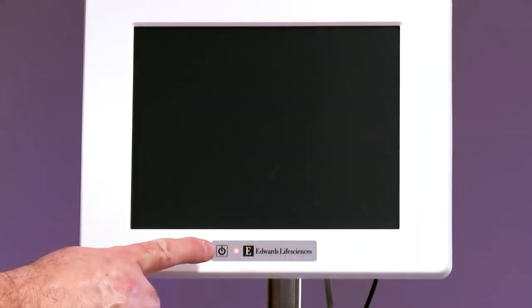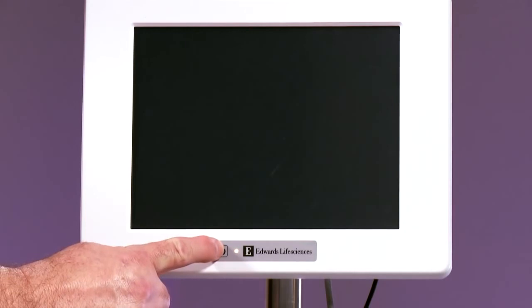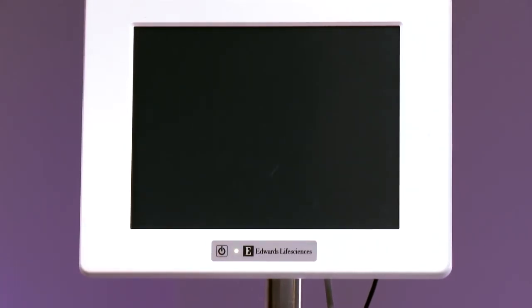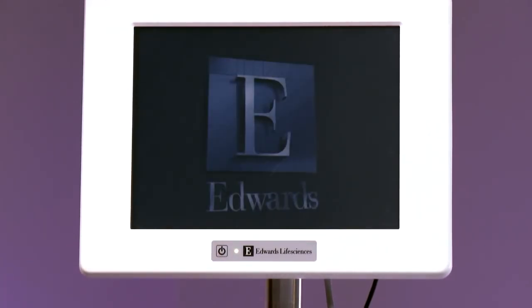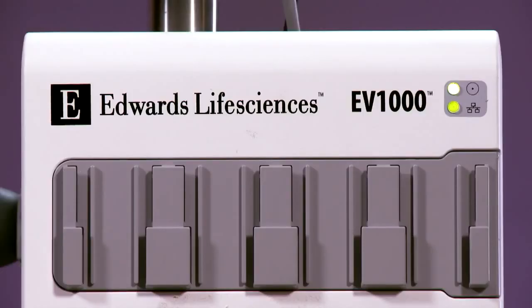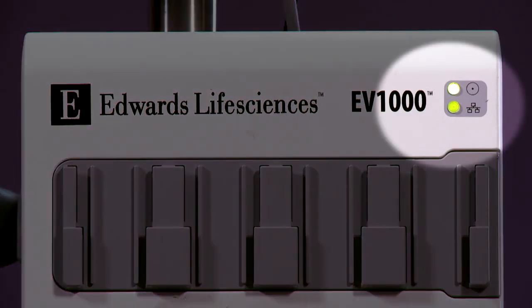Turn on the EV1000 Clinical Platform by pressing the power button on the front of the monitor. Confirm that the data box LED lights are illuminated green.